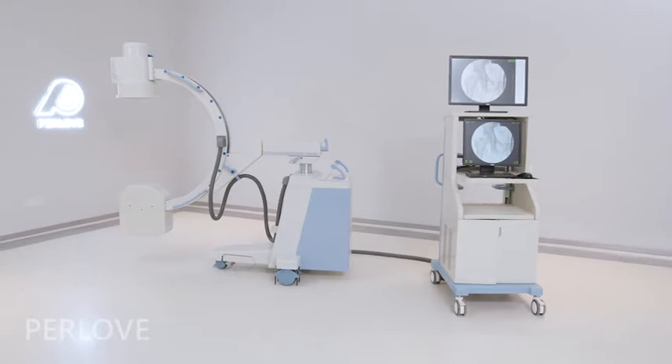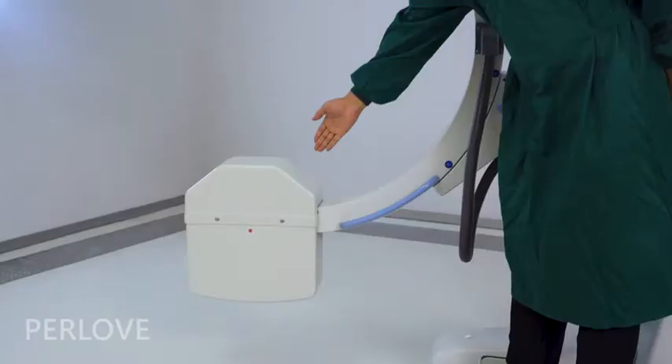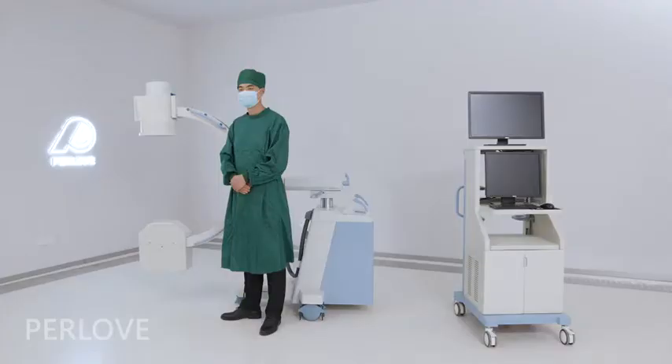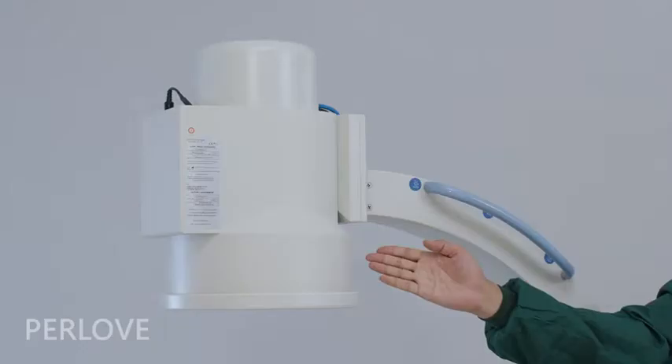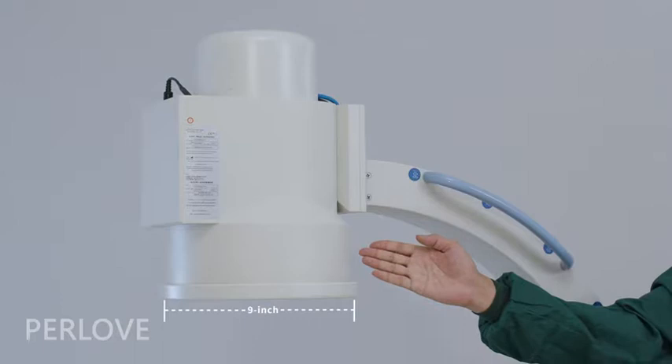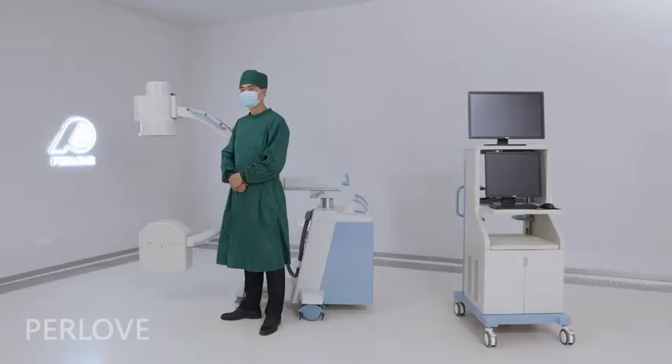With the integrated X-ray tube and generator monoblock design, we can provide high quality X-ray. This machine is equipped with a Canon 9-inch image intensifier, with a 3-view and million-pixel digital imaging system to ensure excellent image quality.